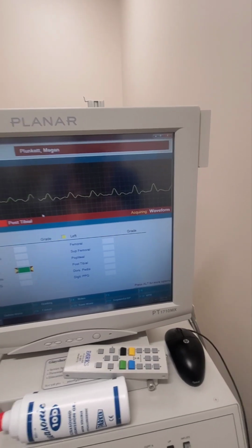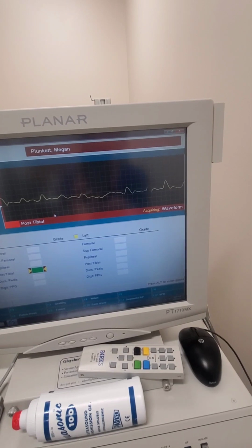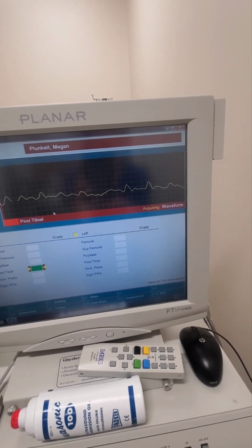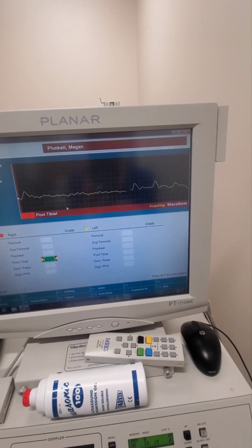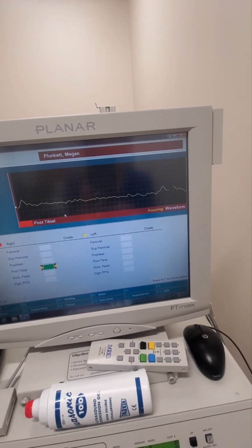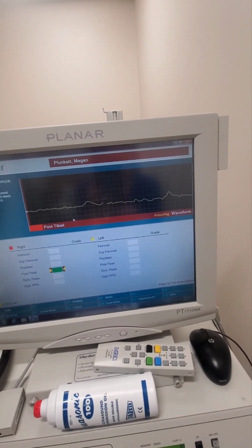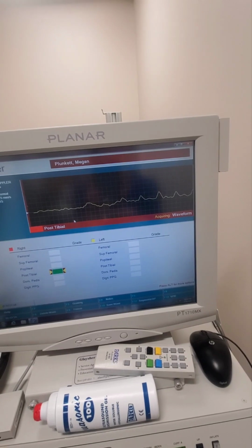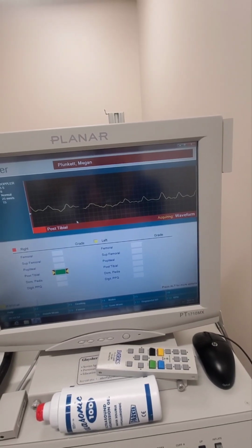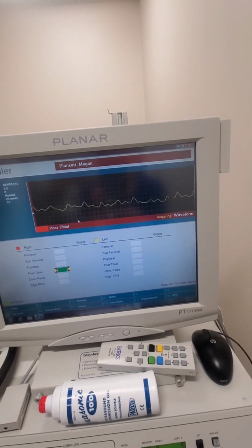So what we get here is we get the waveform, and all we get is the morphology. We're not even recording velocities here. Okay, I fell off of it. There you go. No, no, and we're gone. It's supposed to be more sensitive, but we have that range ambiguity, and what we're getting here is the morphology of the waveform.